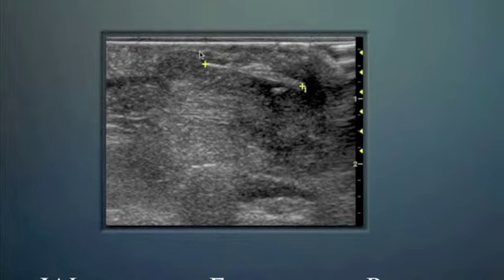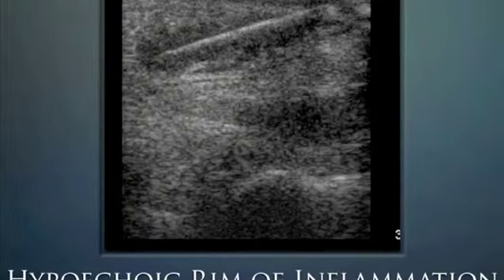And when a foreign body's been there for a while, there starts to be a buildup of inflammation. 3 to 5 days out, you can see this inflammation, or this hypoechoic rim, around this particular woody foreign body here. And this hypoechoic area also helps to visualize it.